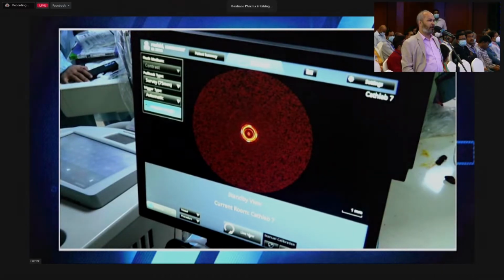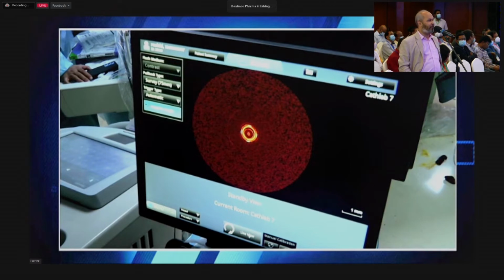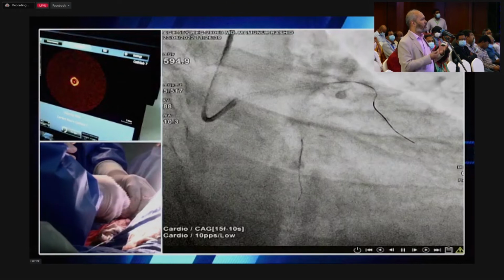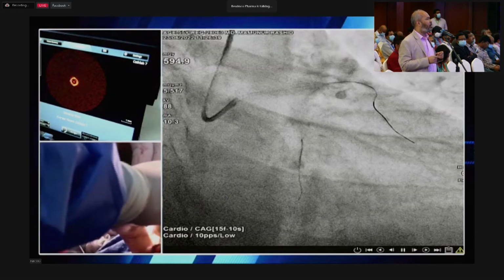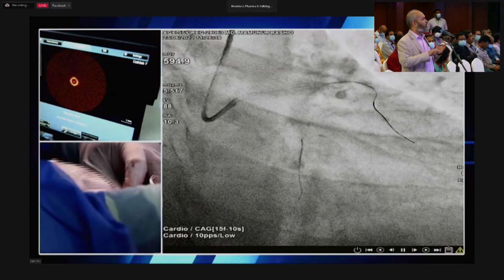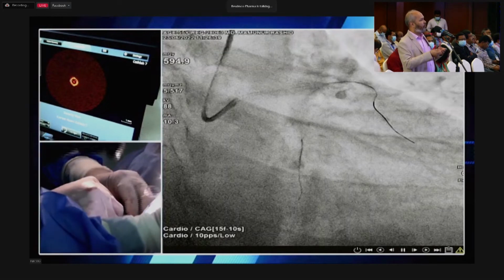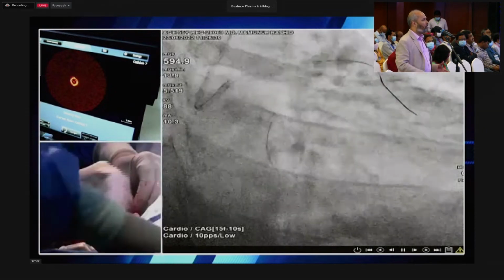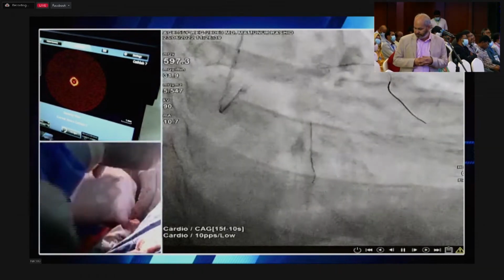From the Japan registry data, sometimes they recommend 20-second inflation, at least 3 inflations for better outcome. So from the primitive era, in the left main, very critical disease, we go straight to inflation and deflation. But what is our aim of the inflation of the stent? Our primary aim is to reshape the memory, so that's why we should inflate first 8, 10, 12, 14, 16, then you can deflate again 16, 14, 12, 10, then go down. Not sudden inflation and sudden deflation. Yeah, I think that's my important recommendation message from my side.